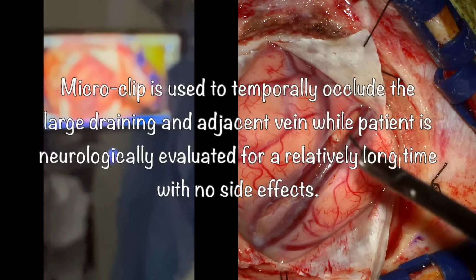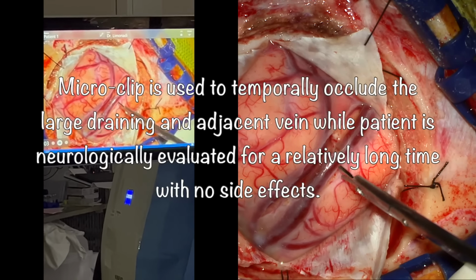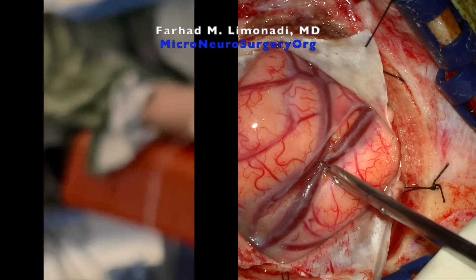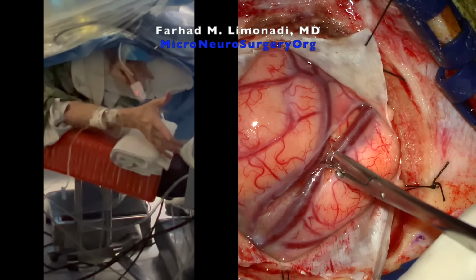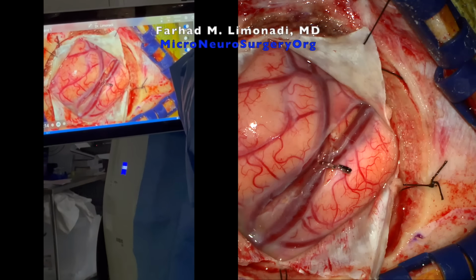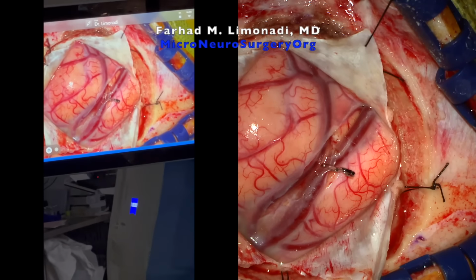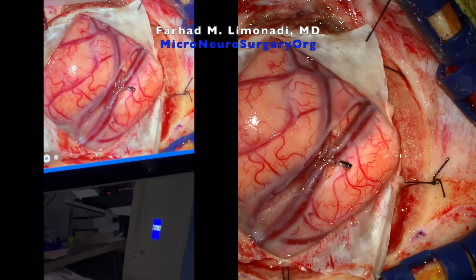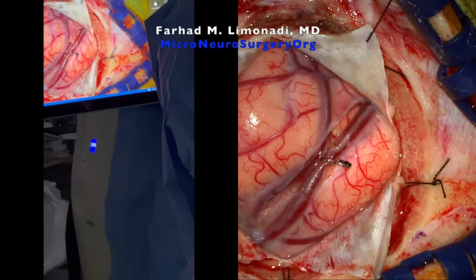Microclip is used to temporarily occlude the large draining vein and the adjacent vein while the patient is neurologically evaluated for a relatively long time with no side effects. Okay. Keep that for a while. Can I see another one? Keep moving them. If that one is going to be okay, the other one's going to be fine.